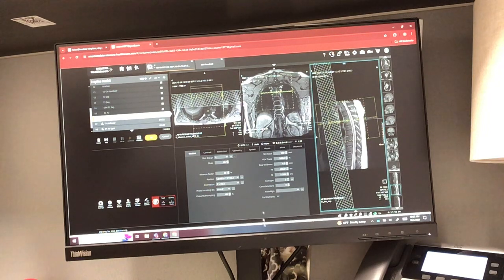Okay, so that's my upper stack. I've covered T1 through T8. I have a little bit of angle to go with these disc spaces. I've placed my rest slab or my pre-saturation band appropriately weighted. I'm going to go ahead and hit go.